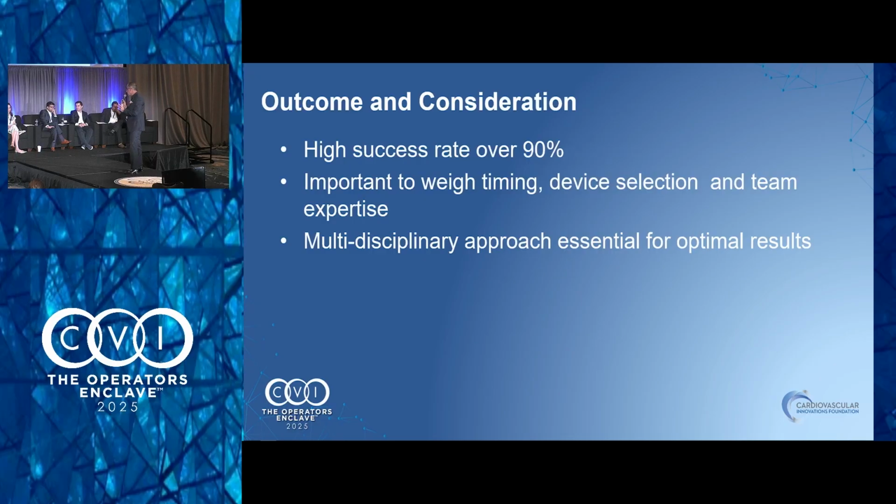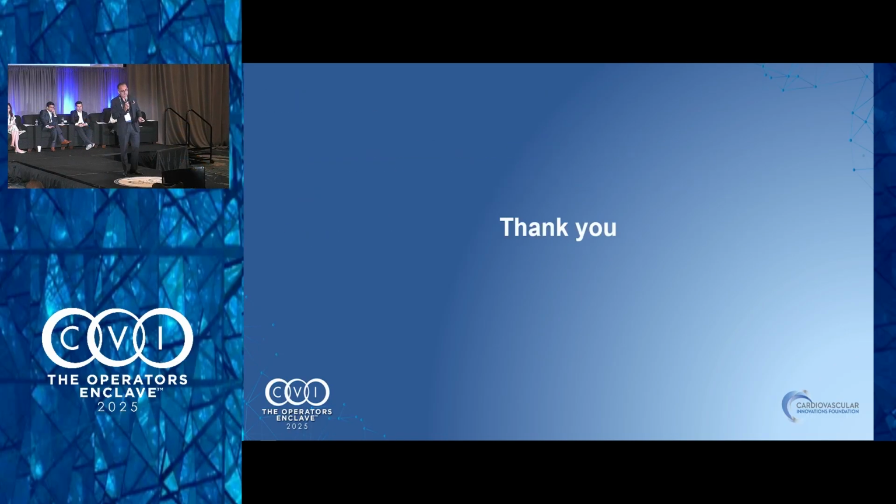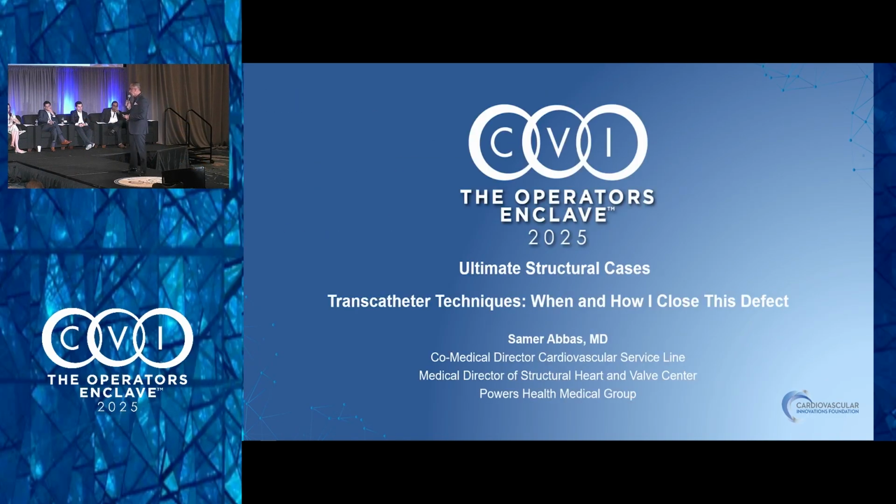And I am about to say, maybe I actually need to change my practice where I should plug them on the way out and be done with it. I heard there's a lot of centers that plug everything. It's like a common practice, not rare. Until now, we plan it case by case, but the fact that this is happening to me 3 times now within 6 weeks, I'd like to know your opinion about closure of those septums, especially with the transseptal approach that's becoming the favorite for mitral repair or all these transcatheter approaches. And thank you.